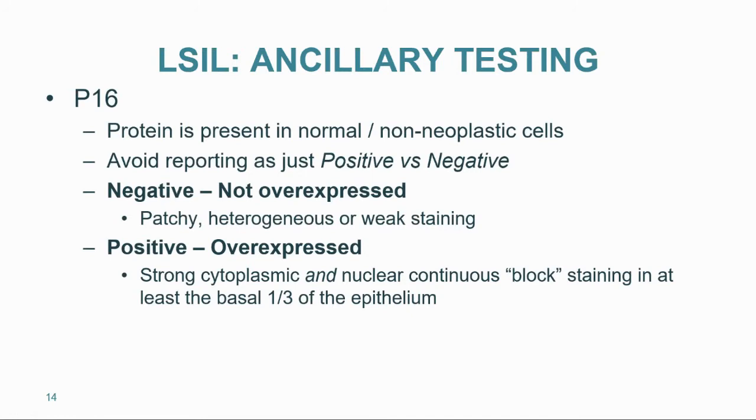In this context, P16 positivity is what we describe as P16 overexpression. So I usually use that term: P16 is positive or overexpressed, versus P16 is not overexpressed.